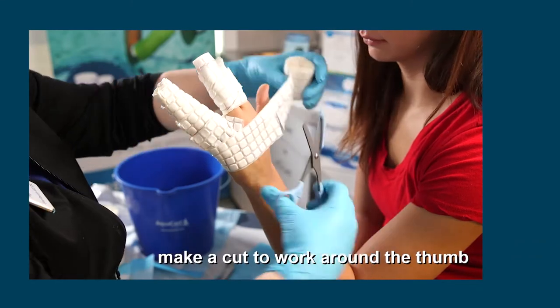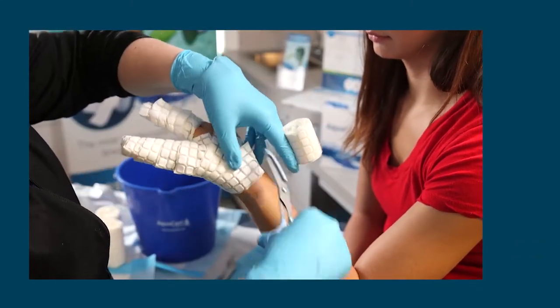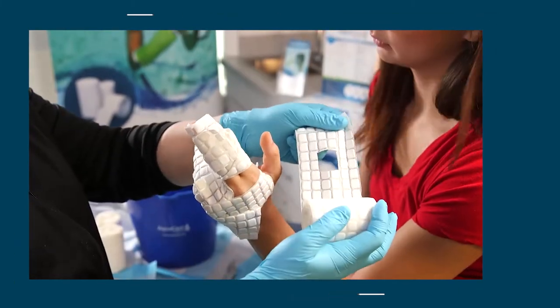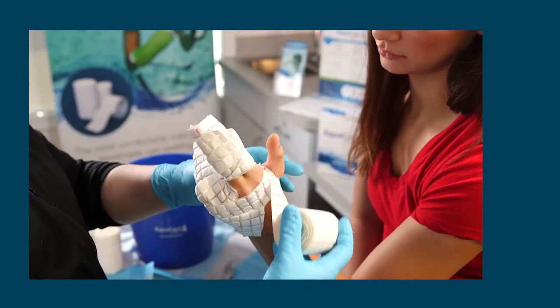Make a cut to work around the thumb and then anchor the material. Begin the short arm cast. You may wish to cut a hole to accommodate the thumb.